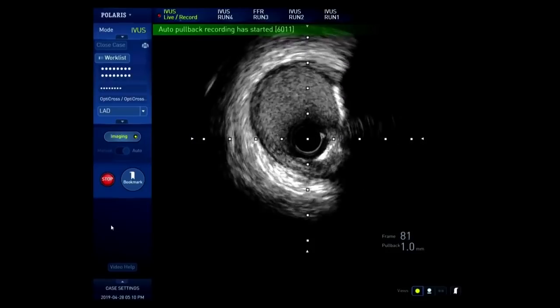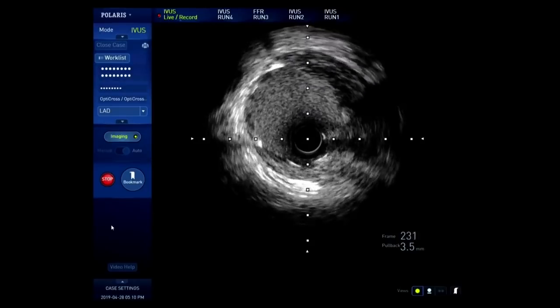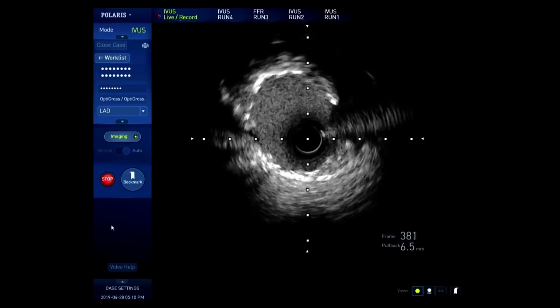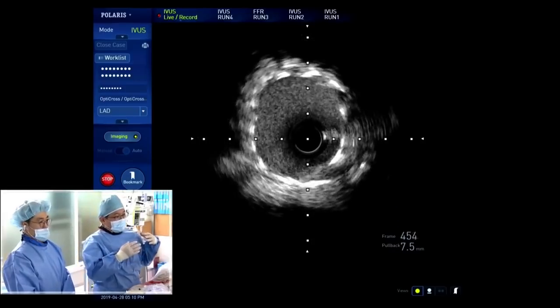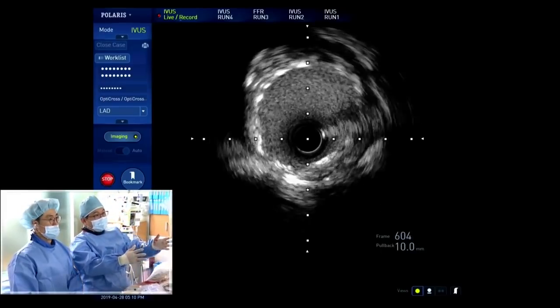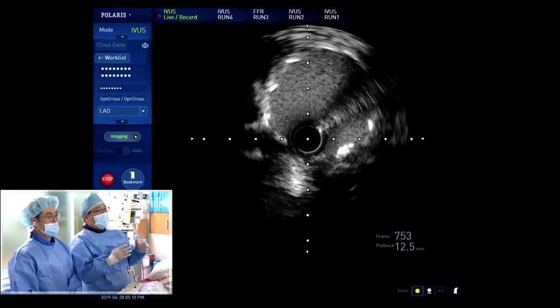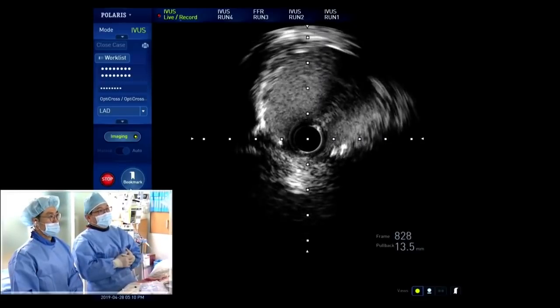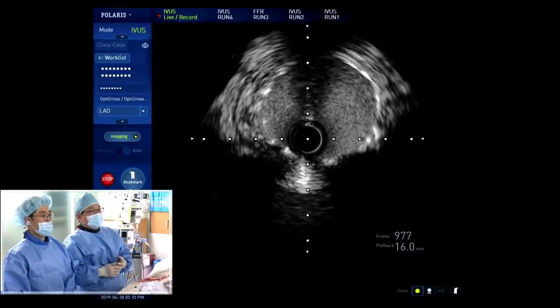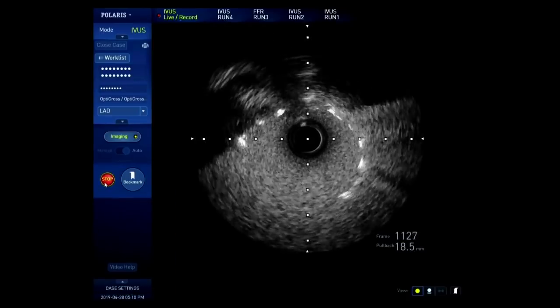Yes, in this case, I don't care how protruded into the aorta because we have to make a distal landing zone. Distal landing is good. The distal landing is more important because my stent is implanted more distally. There is some plaque, so I only focus on the distal landing zone. I don't care about the proximal landing, how much it protrudes into the aorta. But usually, I will use multiple projections to make sure of the ostial stenting. Good. Okay, I covered the 2 millimeter ostium.